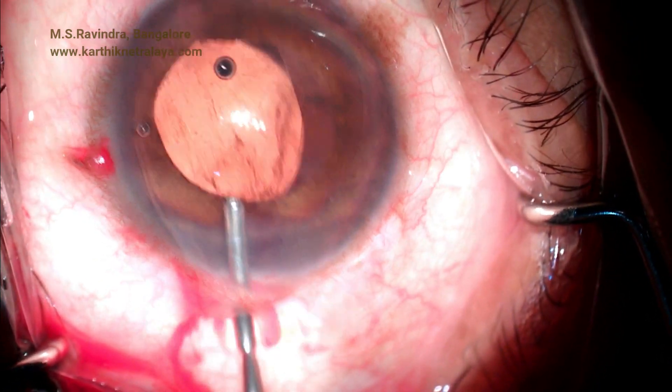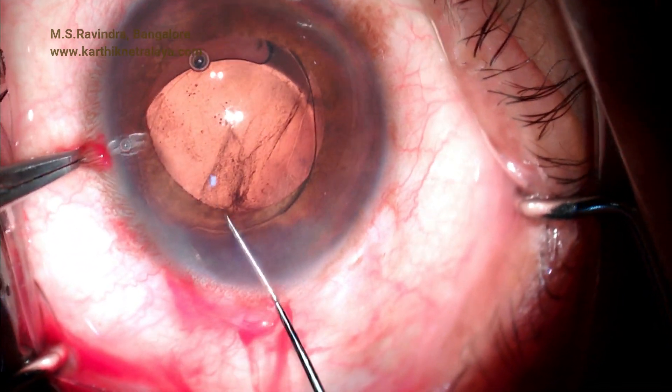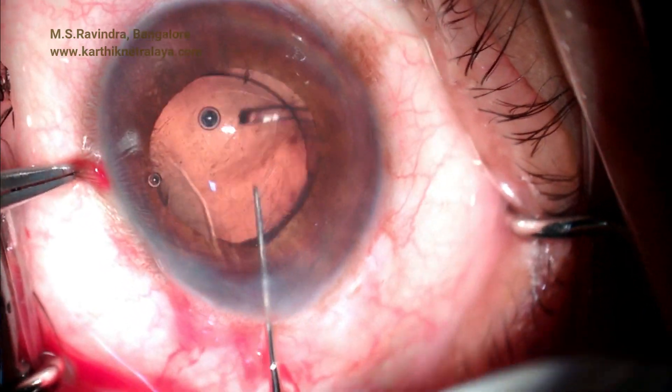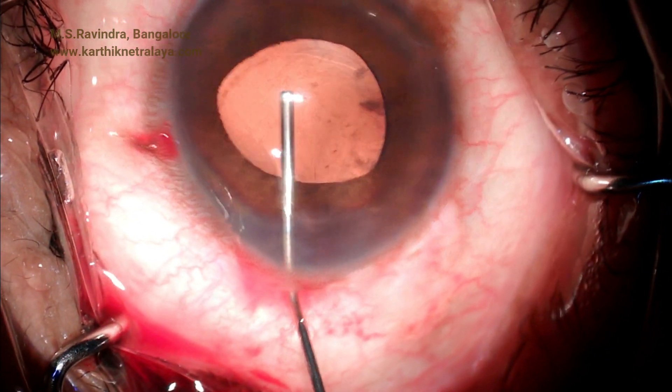This technique of cataract surgery in a mature cataract is extremely safe. This tunnel produces a maximum astigmatism of 0.5 diopters, and this can be utilized to neutralize pre-existing astigmatism. Thank you.